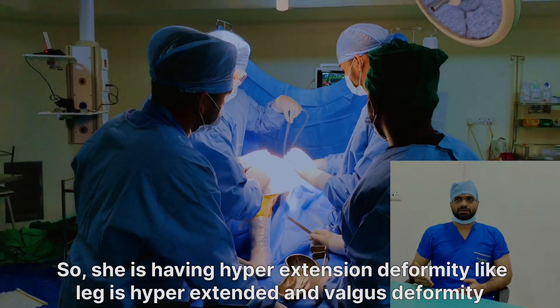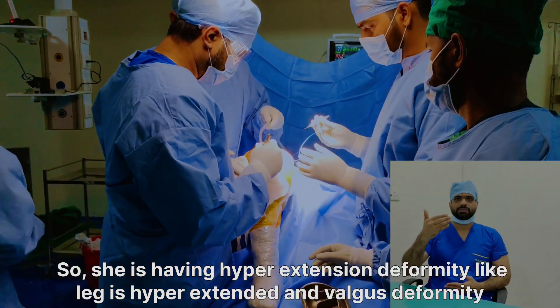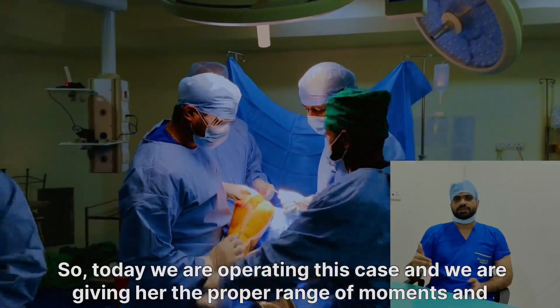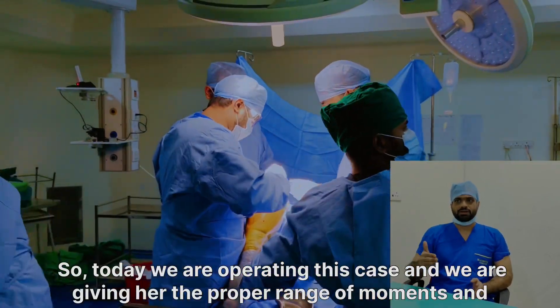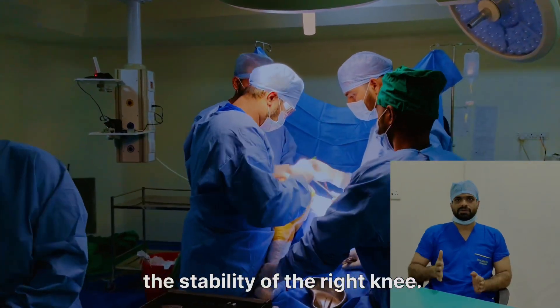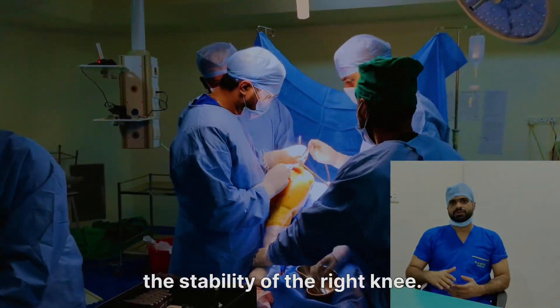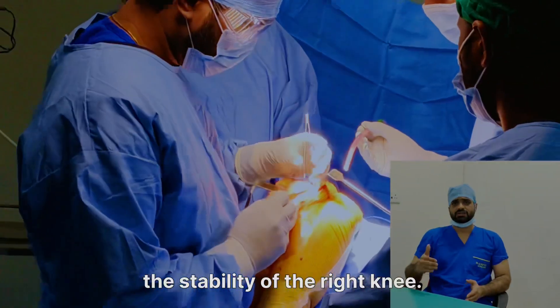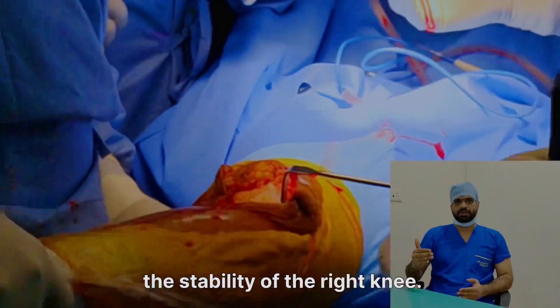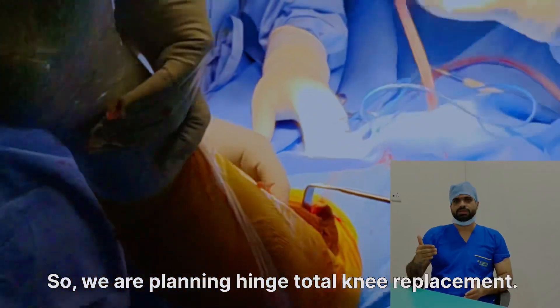She is having hyperextension deformity — the leg is hyperextended — and a valgus knee. So today we are operating this case, giving her proper range of movements and stability of the right knee. She was having a lot of pain because of this and arthritis of the knee. So we are planning a hinge total knee replacement.